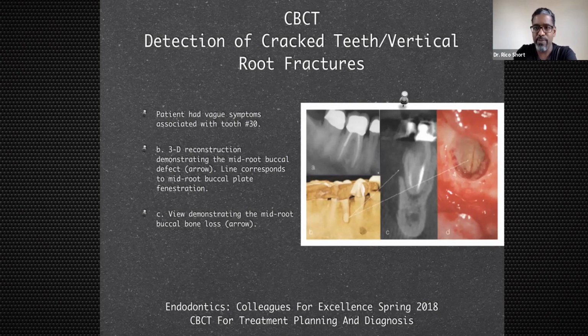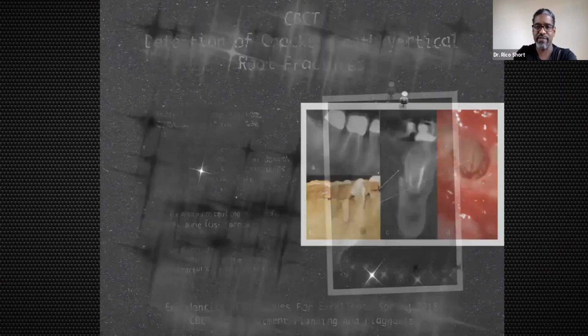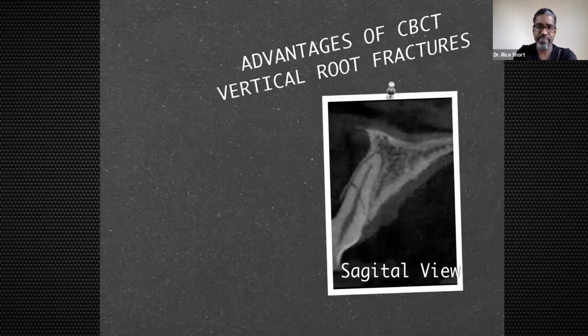And if it's very small, you won't be able to see it, like I said, on the 3D CBCT, especially if it's a root filled tooth and has a post like this one. It'll be very difficult to see the actual fracture. You have to do a surgical exploratory surgery and move it and clean it all out. And then you can see the fracture in most cases if it's there. And then that tooth would have to usually be extracted.